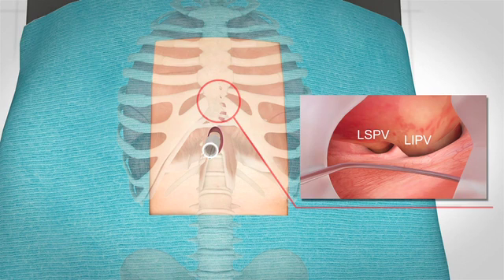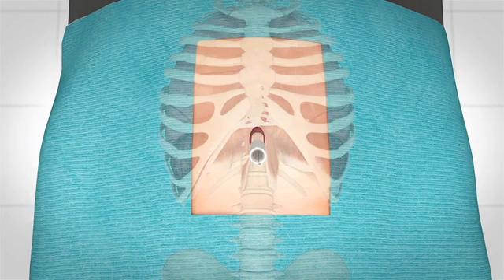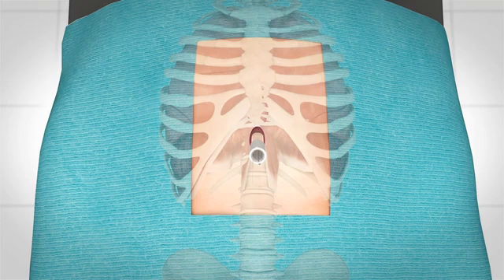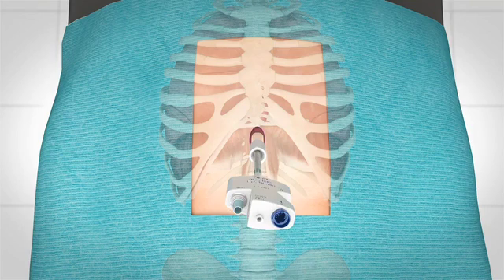The superior pulmonary veins a lot of times will not be directly visible, but sometimes if you can get up as high as possible, you can see that. You want to pre-shape the ablation device before you insert it through the cannula so that you can actually access it and advance it, deflecting it off the pericardium up as high as possible to approach those posterior pericardial reflections along the roof to the left atrium.